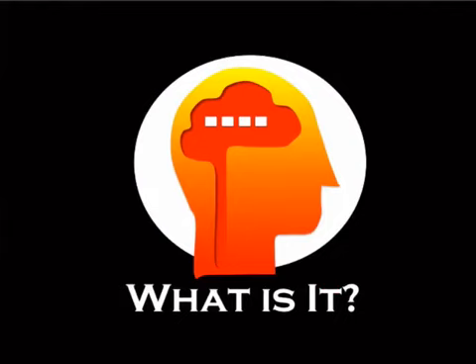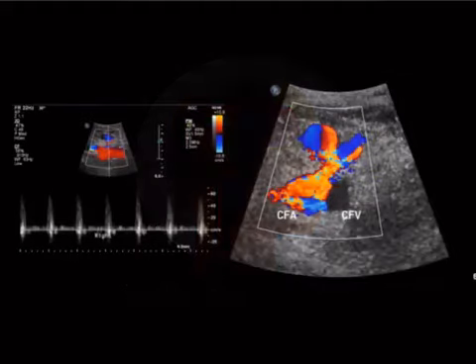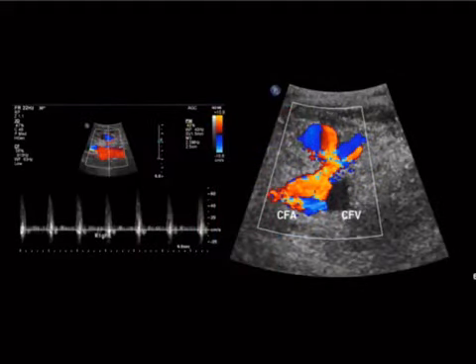All right, so let's say instead of going to IR, the patient goes to cardiology and gets a groin puncture. So the most common finding after a trip to the cardiologist is this. We've got a classic yin-yang. We've got arterial pulsation here. So this is a pseudoaneurysm.